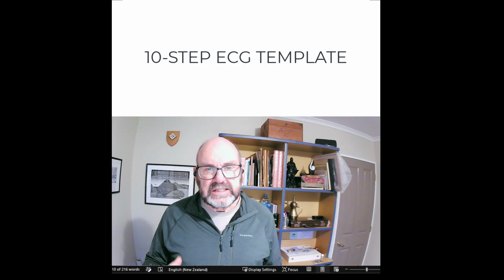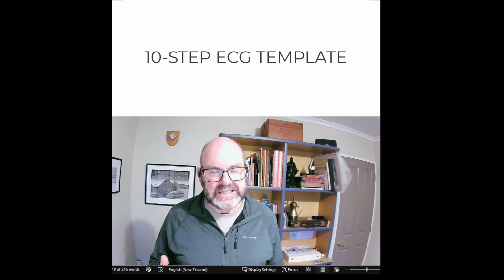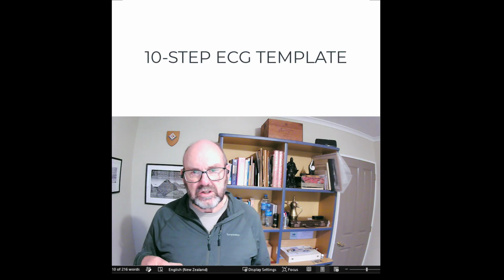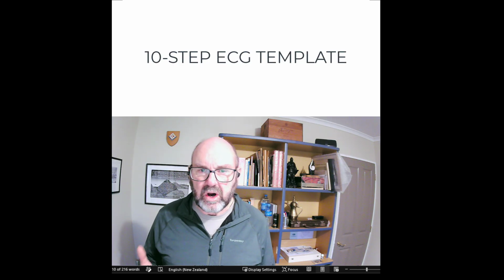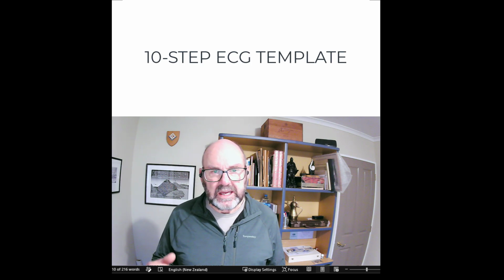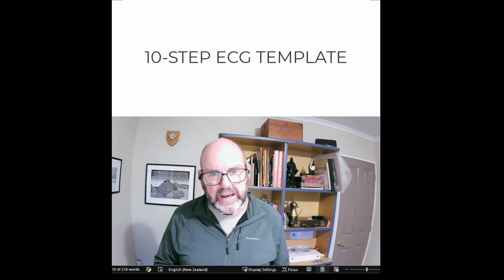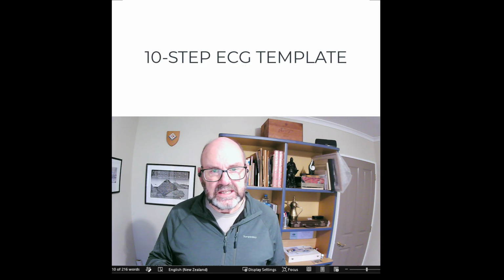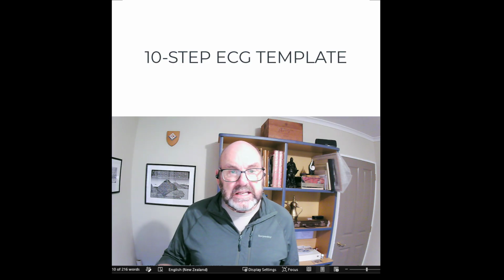First and foremost, the 10-step method provides a structured way to collect and then process information from an ECG. And as this course has a strong focus on recognising risk and supporting diagnosis outside of the STEMI paradigm, there's going to be a deeper dive into the intervals, the duration, the morphology of waves and the like. And the data acquisition phase of the 10-step is the foundation for this analysis.